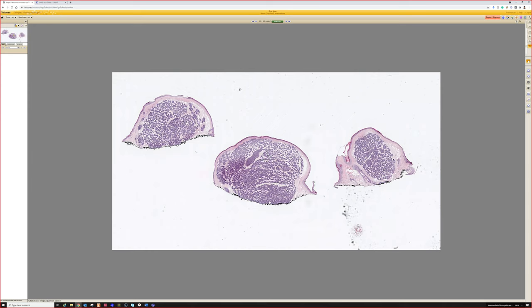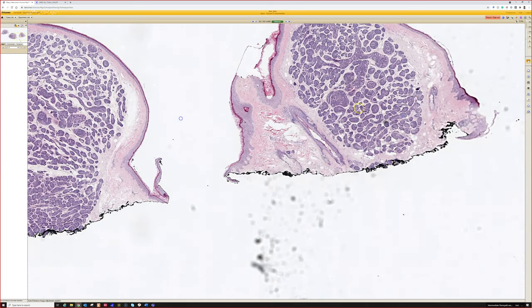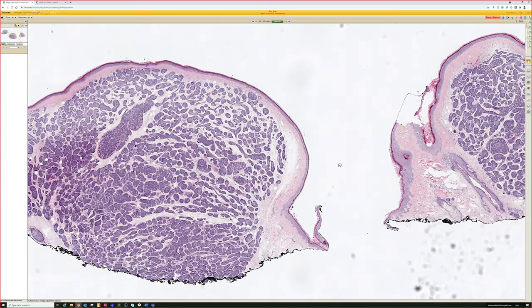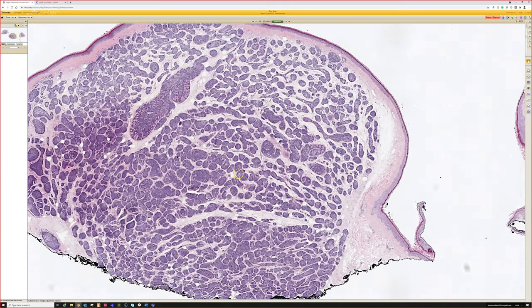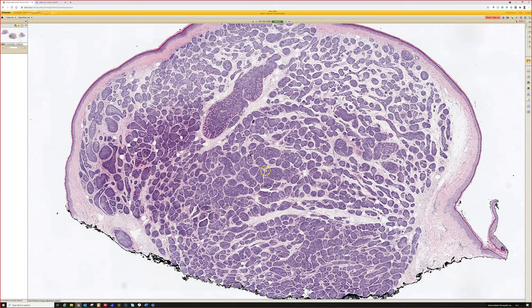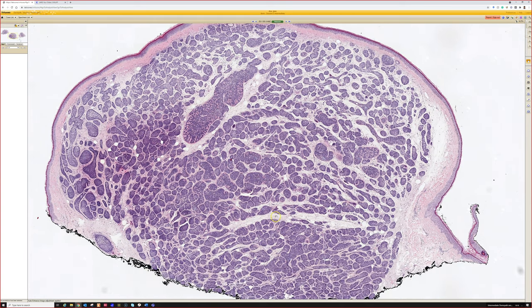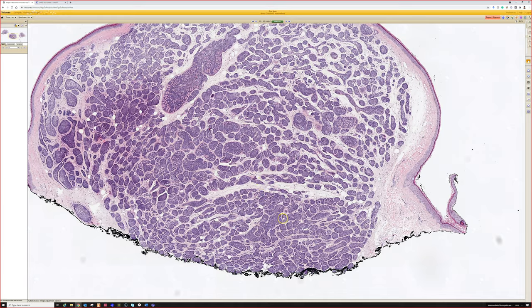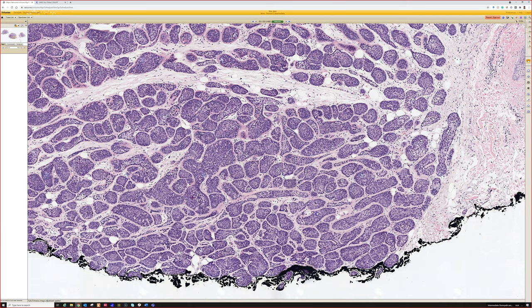Case three. Cylindroma, that's right. And they are blue tumors usually, whereas the hidradenoma we looked at earlier is more of a pink tumor most of the time. Cylindroma and spiradenoma, which are basically like brothers or sisters, are very closely related. They are very blue and basaloid from low power. And when you go in closer, you can see that the individual nests fit and mold together with each other. People have likened this to puzzle pieces.